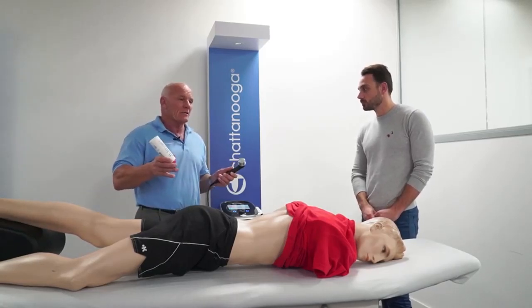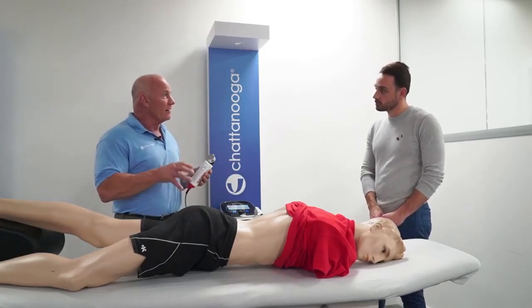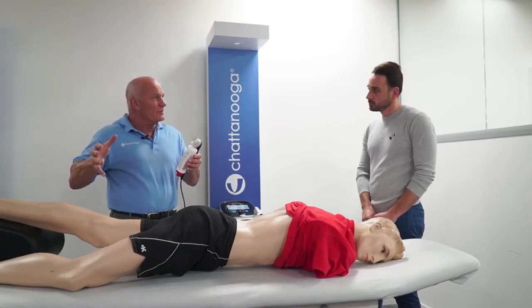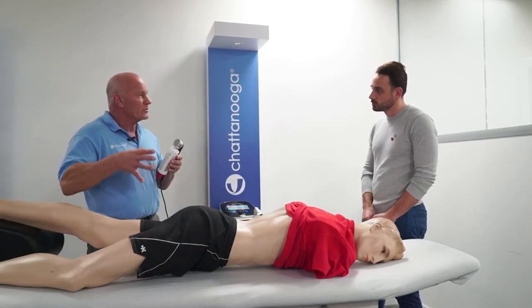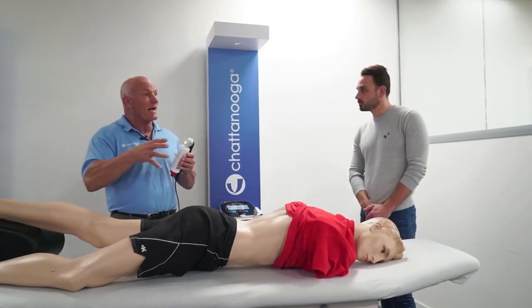And I say, yeah, because it's going to take you that number of treatments. So if I can condense those, then I can really relieve your symptoms much quicker. If I only do it once a week, I will have an effect, but it's going to go on, you know, for a longer period of time.